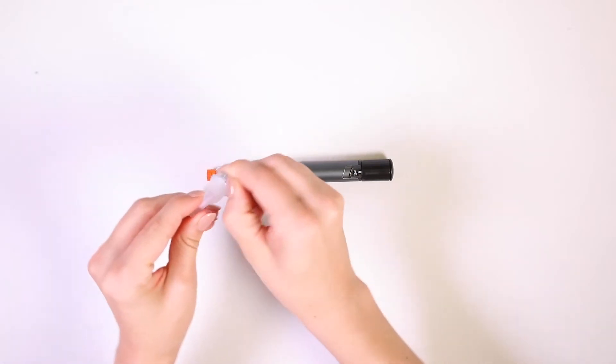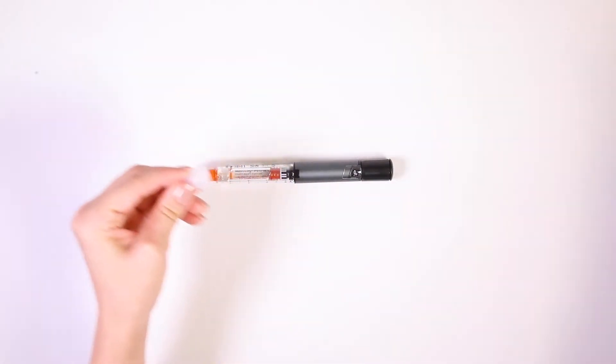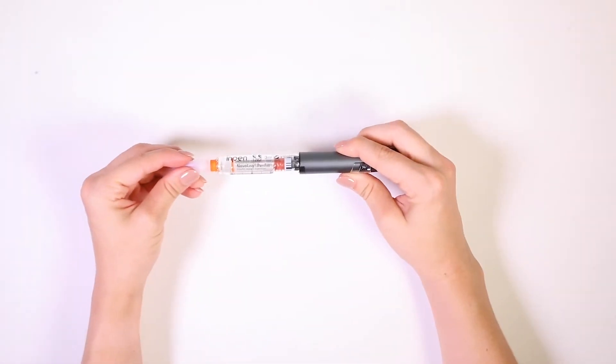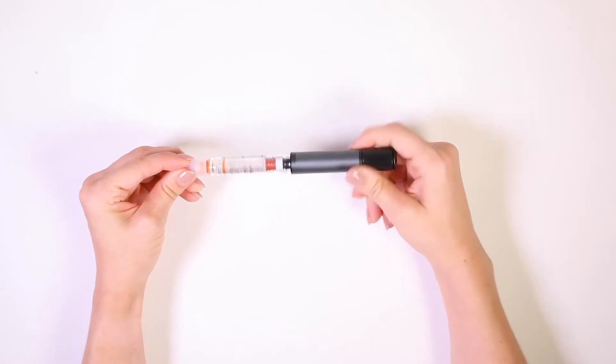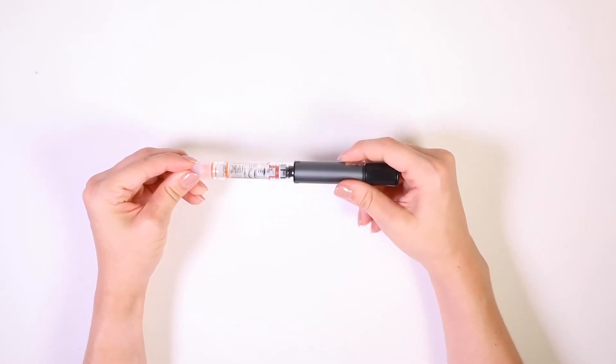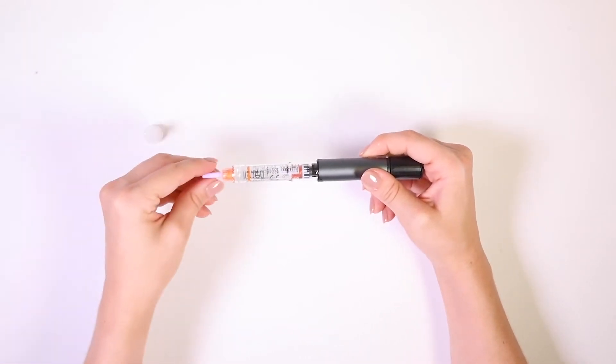To place the insulin needle, remove the needle package and put the needle straight into the tip of the InPen. Then twist the pen clockwise until it's tight. Next, pull off the outer needle cap and save it for needle removal later.